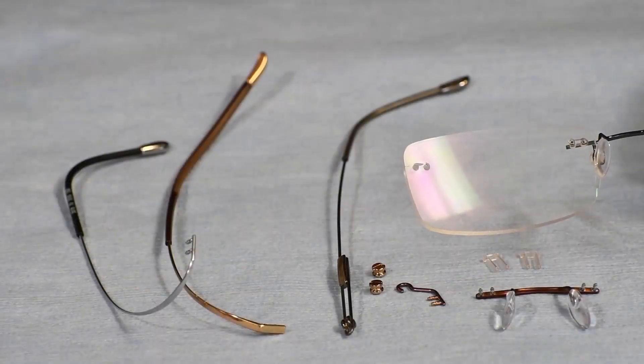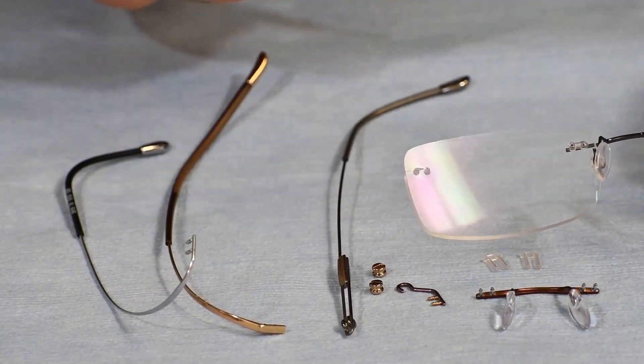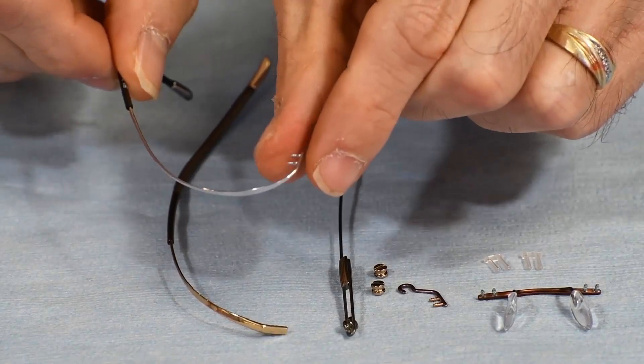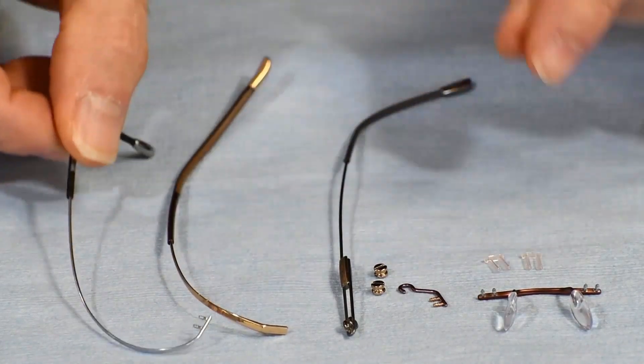We'll start with the frame apart and start with the temple mounts. The two holes right here are drilled through the lenses on the Silhouette frame, and the temple will mount right through there. Now the first temples that came out were actually hingeless and actually flexed back and forth.